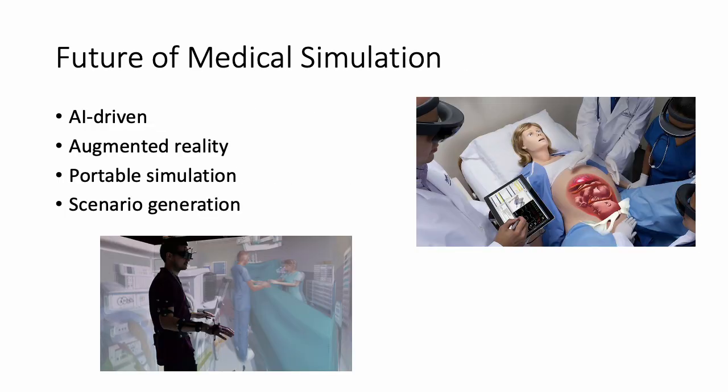The future of medical procedure simulation is bright. With the increase in the use of artificial intelligence, simulators will have the ability to adapt immediately to the learner's medical decisions. They will be able to use real patient data and directly simulate it in a model. The use of augmented reality will be able to overlay internal anatomy during procedures for a real-life scenario, pictured on the right. Related to the military, this is extra important for our forward resuscitative surgical detachment teams to ensure they are training on a variety of scenarios in the operating room.